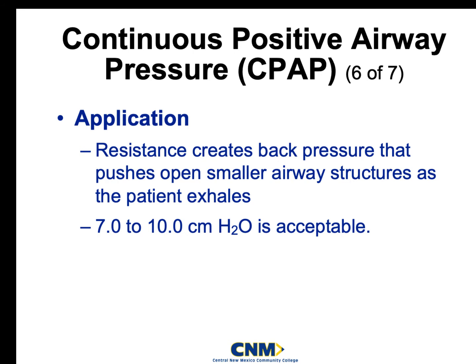That back pressure pushes open those really smaller, microscopic airways wide open as the patient exhales, in order to prepare for inhalation again. Because that back pressure is created during the exhalation process, during the PEEP process, when we take that next deep breath in, our lungs are already situated and prepared for adequate respiration or gas exchange.